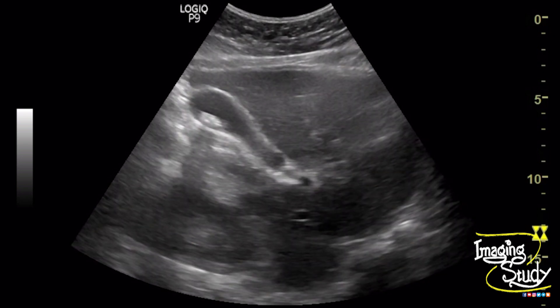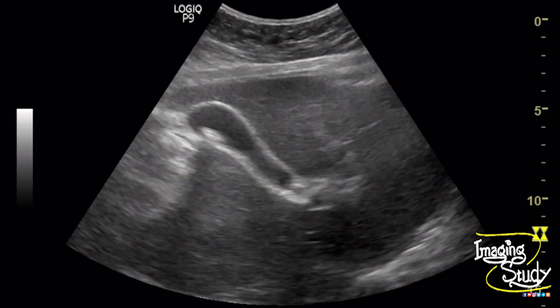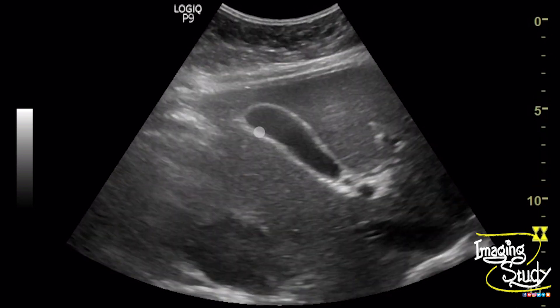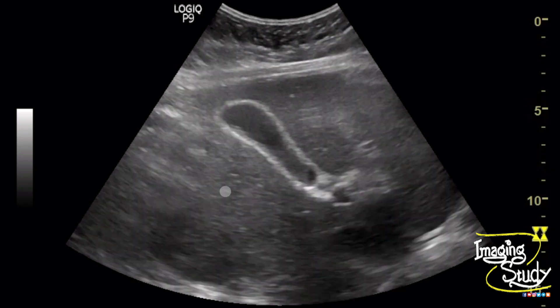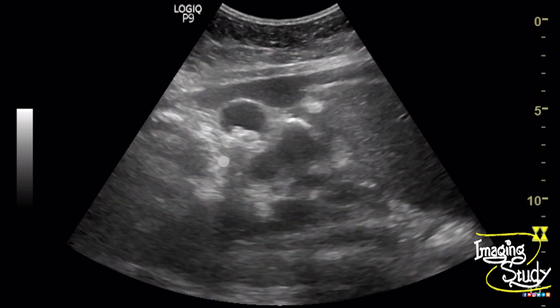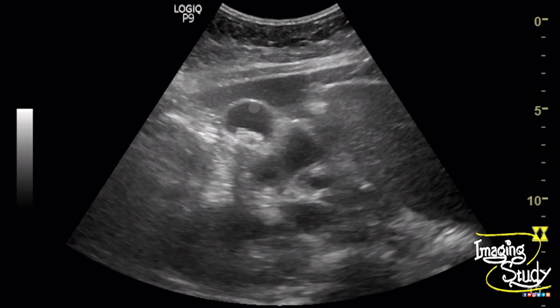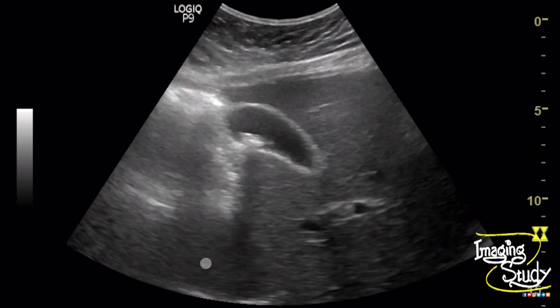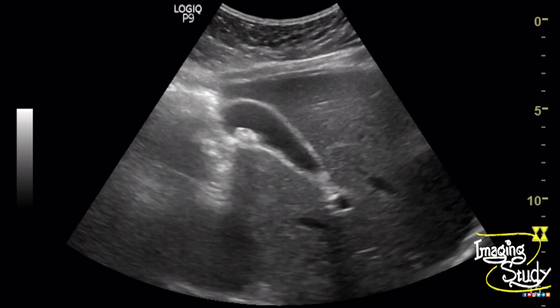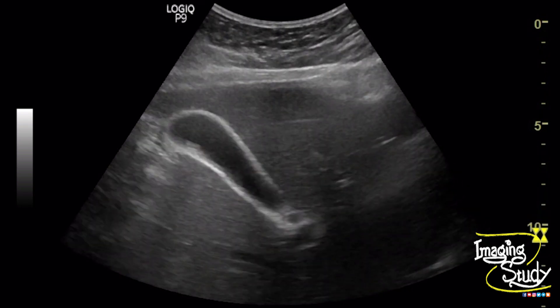You can see the long section of the gallbladder showing a bright echogenic structure casting posterior acoustic shadow near the fundal region. The structure changes position with posture changing.